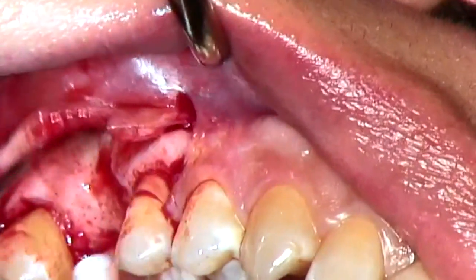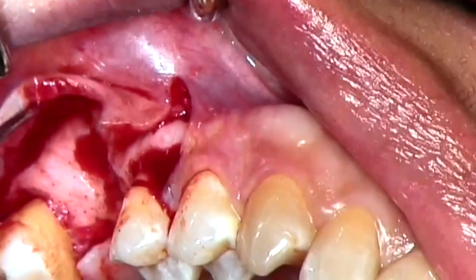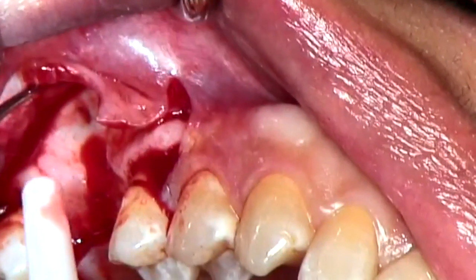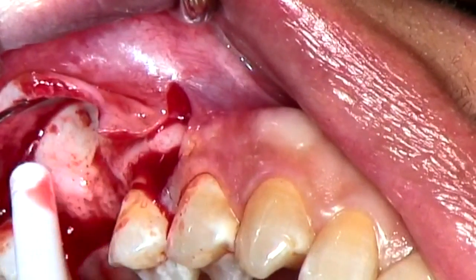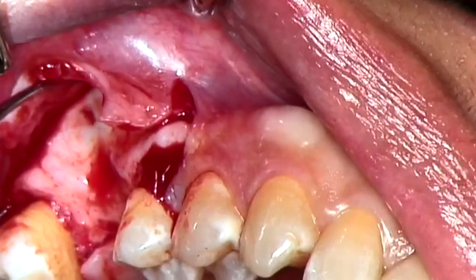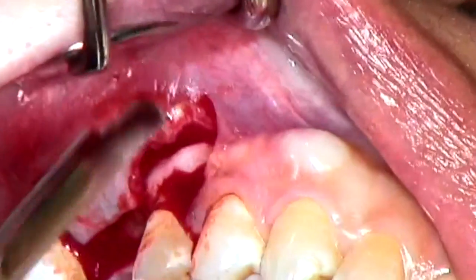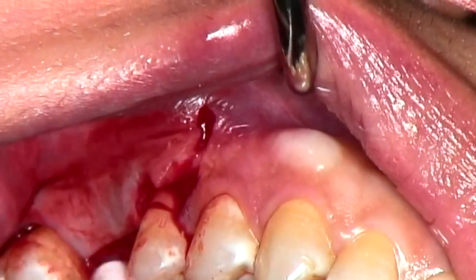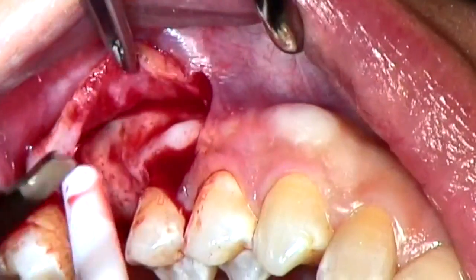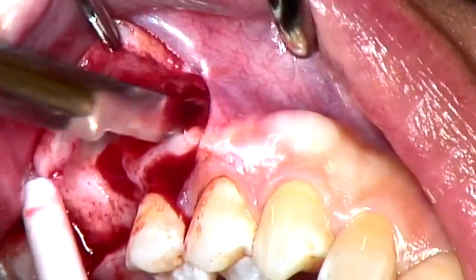Now we start to get good control of the area that we are going to access. Unfortunately, the mouth opening is not very favorable and there is some small attachment of the soft tissue. I can see there is almost a small fenestration of the sinus — I can see the membrane shining through this tiny little fenestration, so it is almost self-exposed. I will have to extend slightly our mesial incision to have better control of the tissues.